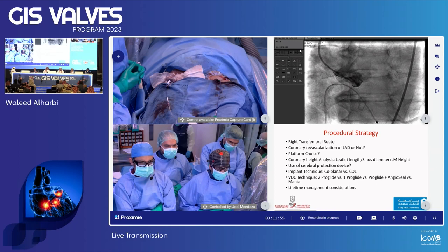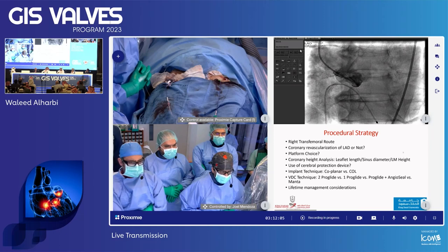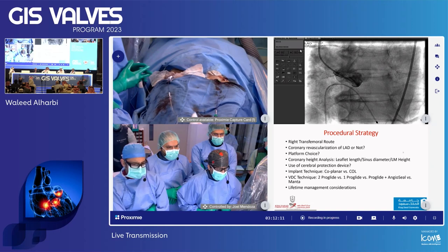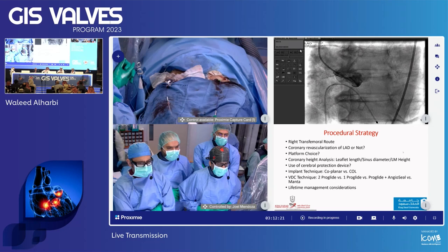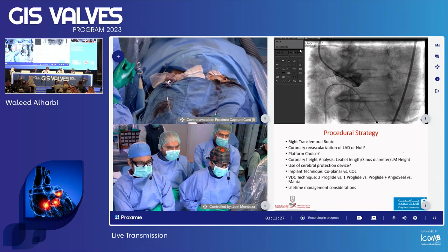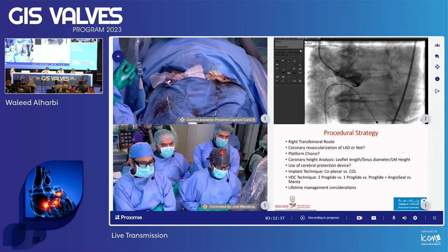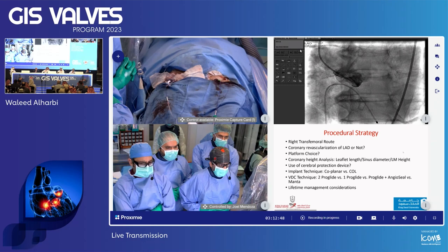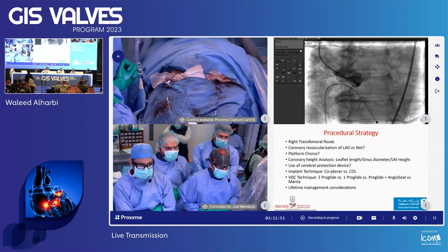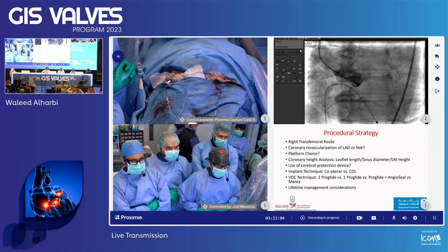Regarding closure technique — two ProGlide, one ProGlide, ProGlide and angioseal, or MANTA? I would usually deploy two ProGlides in a relatively small femoral anatomy, but try to only tighten one at the end. If I get a good result, I cut the other without tightening it. Regarding coronary revascularization and lifetime management, I want to place a valve that ensures future coronary access. If using a long-frame valve, ensure commissural alignment. I would go for the valve first, as stable coronary artery disease in the absence of symptoms is relatively benign compared to severe aortic stenosis.